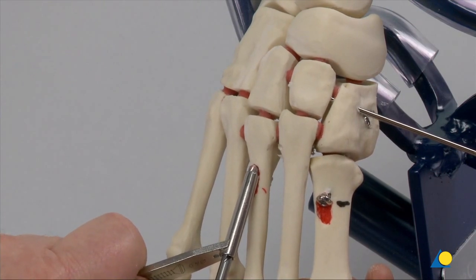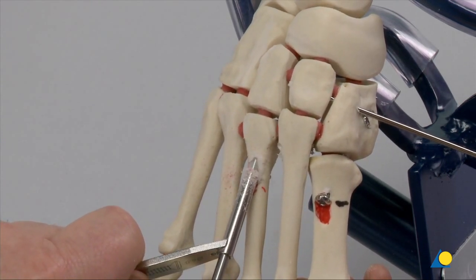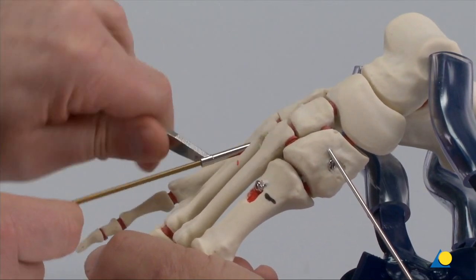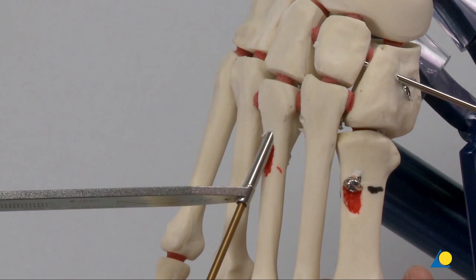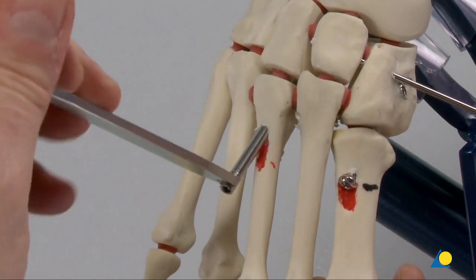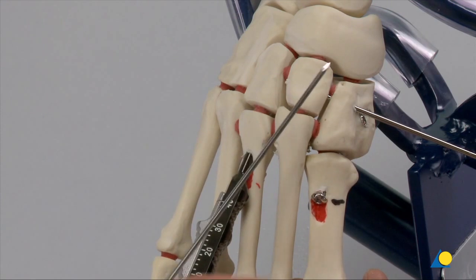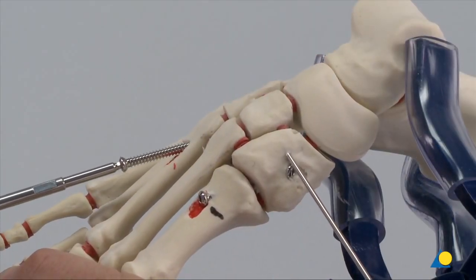The 4.0 mm glide hole is drilled to the base of the third TMT joint. The 2.9 end of the double drill guide is wriggled into the 4.0 mm hole to guide the insertion of the 2.5 mm drill bit. A 2.5 mm thread hole is drilled from the base of the third TMT joint to the base of the lateral cuneiform. The end of the double drill guide is wriggled out of the hole. The depth is measured. Screws can also be inserted into the navicular to further stabilise the foot in the case of intertarsal instability. The appropriate length self-tapping 4.0 mm cortex screw is inserted.